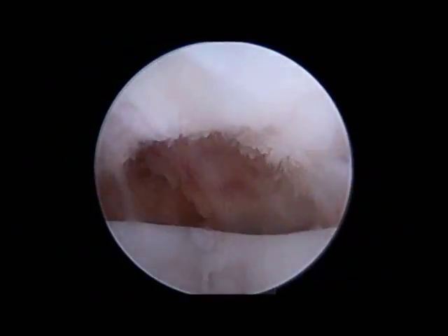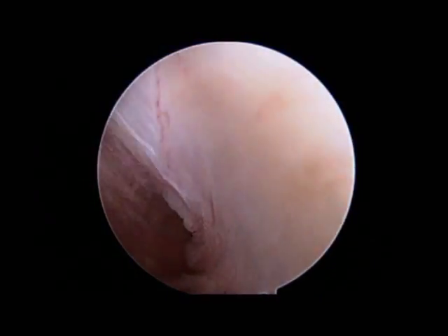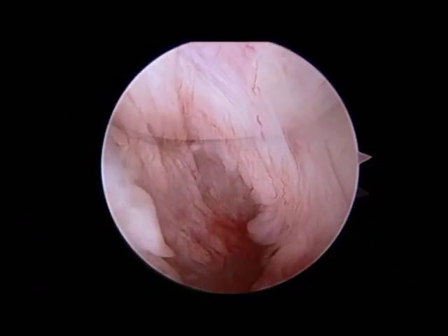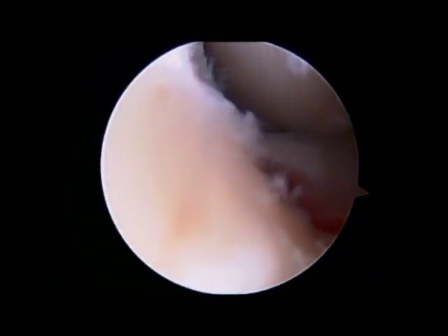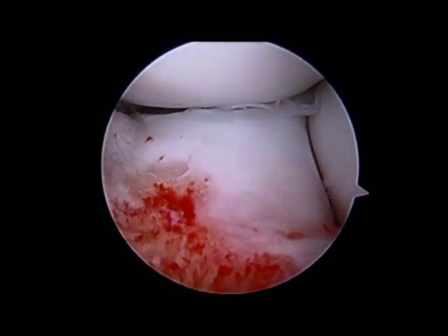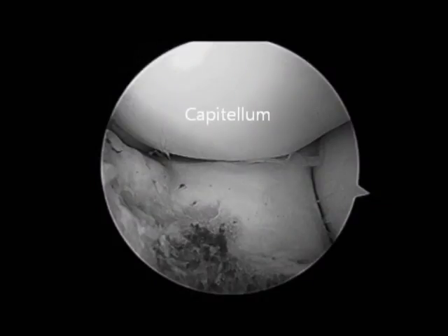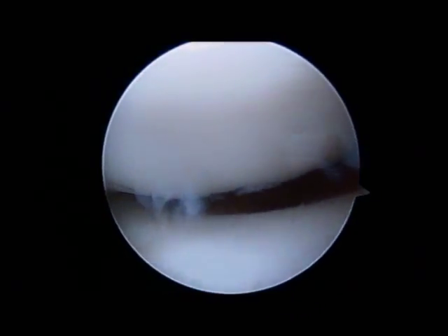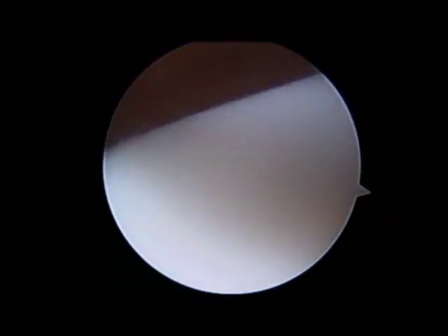The joint is then inspected thoroughly. You can see the medial gutter here, and the lateral gutter will also be inspected — these are common sites where loose bodies can hide. Some of the anatomy is demonstrated here: the capitellum is up above, the radial head is to the right, and the proximal ulna is down below. This is a different angle of looking at the OCD lesion we were examining before.